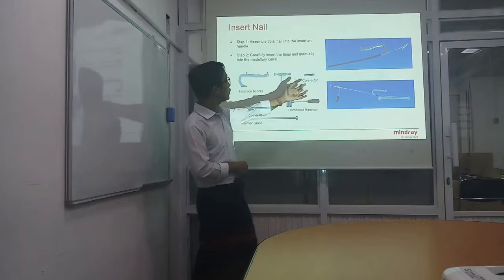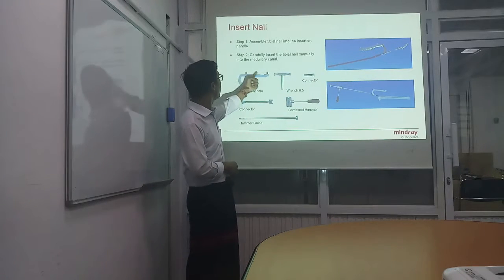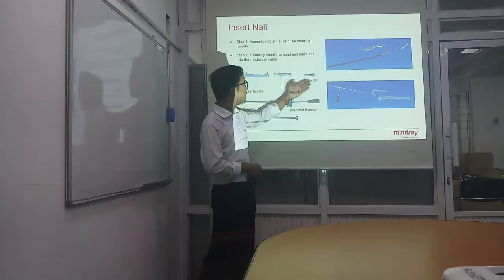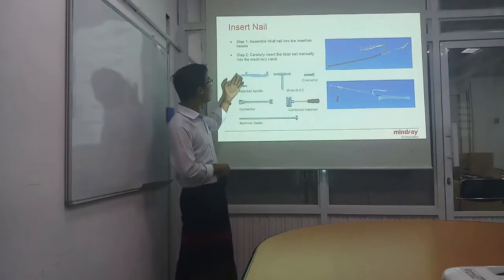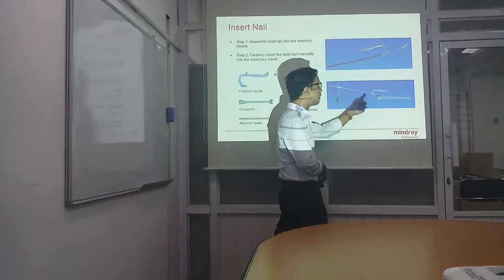This is the assembly of the nail procedure. Firstly, assemble the tibia nail to the insertion handle. Step 2. Carefully insert the nail manually into the medullary canal using the sliding hammer.